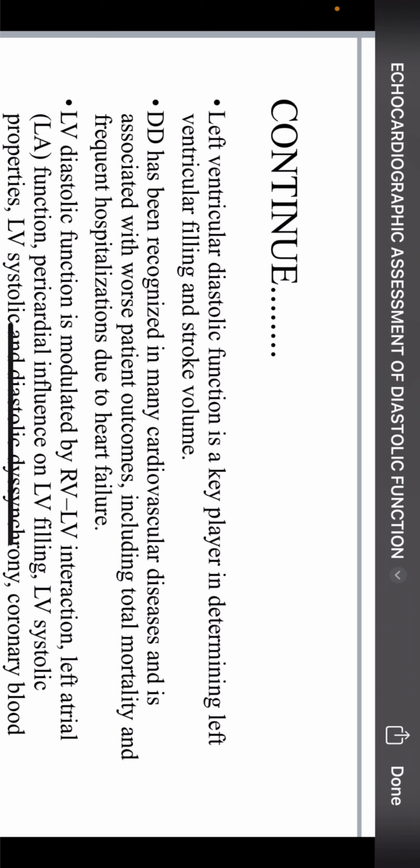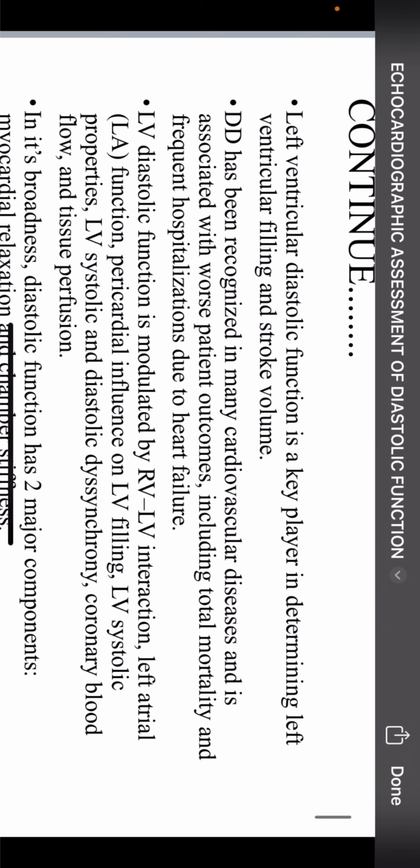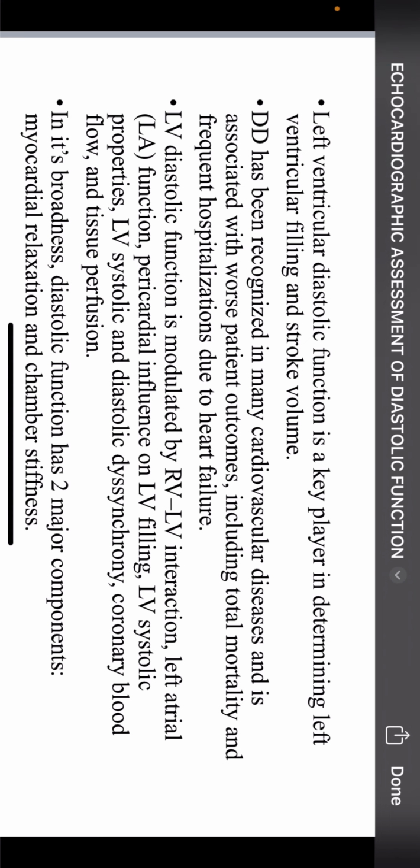Once systolic function is assessed and wall motion abnormality is assessed, they stop there. So there are many mistakes or errors done during echocardiographic assessment of the heart, including forgetting to assess diastolic functioning.